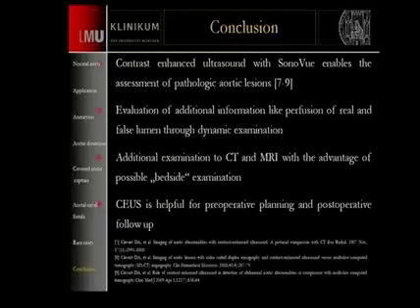Of course, if we find an aortic dissection in the grayscale image, we need the CTA because we want to know how far the dissection goes. The thoracic dissection is next to the heart, does it go into the carotid arteries, so this patient also received a CT. But in the follow-up, on the intensive care unit, you can examine this patient at the bedside and compare whether both lumina still have contrast uptake or not, or what about the perfusion of the kidney, and there's no need to bring this patient again to the CT or the MRI department. You can do this on the intensive care unit next to the patient in a bedside examination.